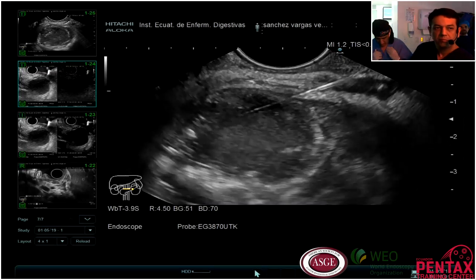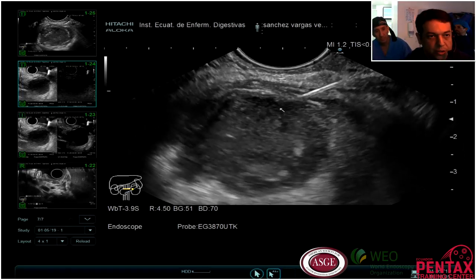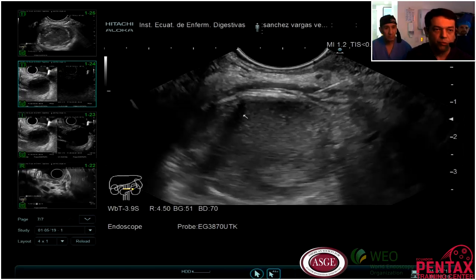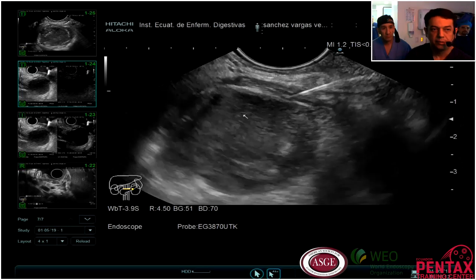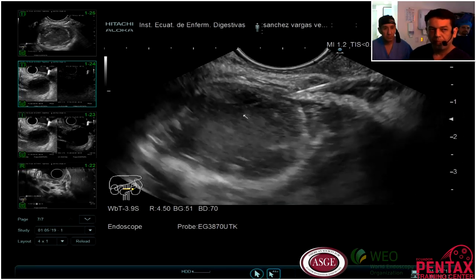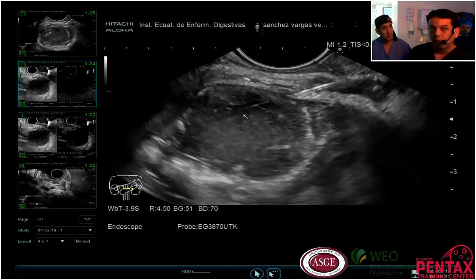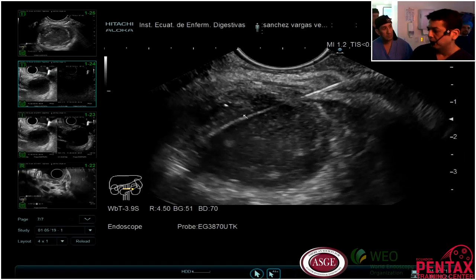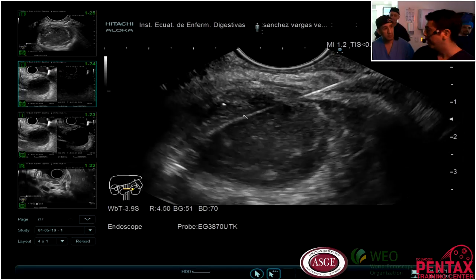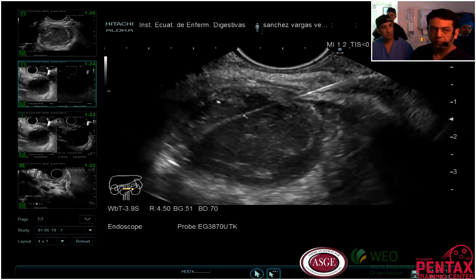It's fantastic. So this is very important when you are doing the technique, to see your guide wire, moreover if you are doing that in the biliary tract. The other tip is very important that we have 3 centimeters at least when you use axios, because you need to open the distal part, and then we need to retract.